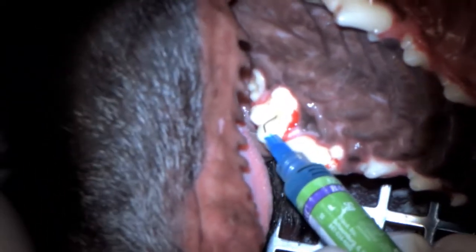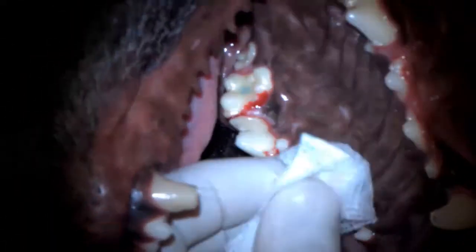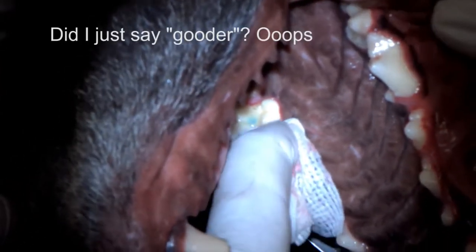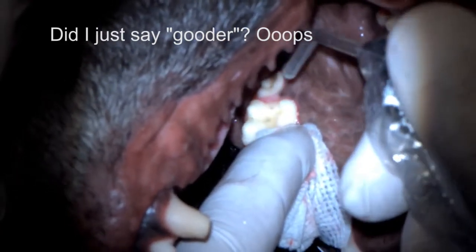37% phosphoric acid gel — to demineralize the dentin and the enamel, open up the dentin tubules, and let our bonding agent get a better grip. It should sit there for about 10 to 15 seconds, then a thorough rinse.